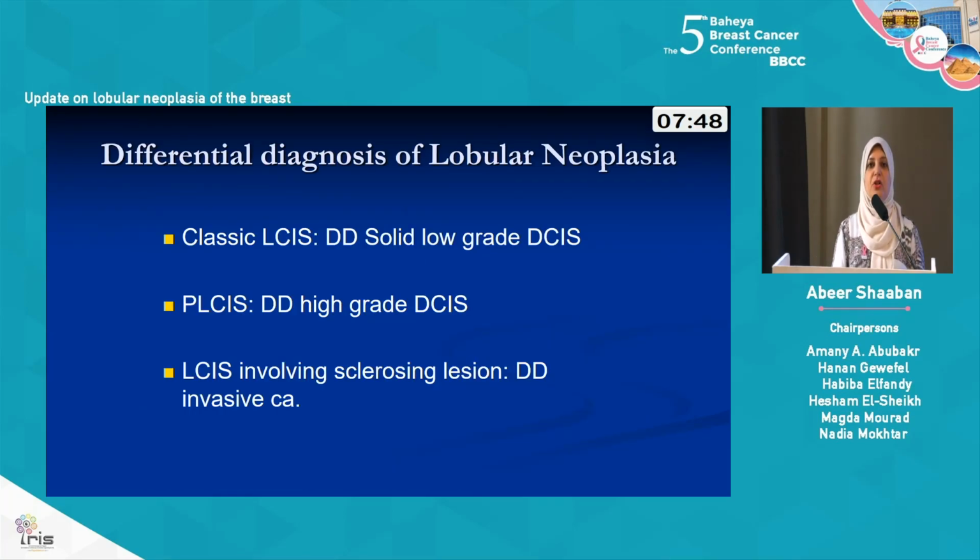So what's the differential diagnosis of LCIS? Depending on which type. Classic LCIS can be differentiated from solid low-grade DCIS. PLCIS mainly from high-grade DCIS, and if it is the apocrine type of PLCIS, the differential is apocrine high-grade DCIS.